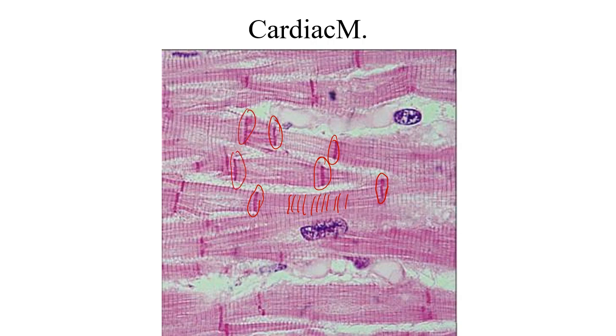If you remember back to cells, gap junctions allowed us to transfer substances from one cell to the next. In this case, it's going to be things like sodium, potassium, and calcium going from one cell to the next. Cardiac muscle also has the ability to branch, so it doesn't just go in a linear direction, it has branches coming off and things like that.